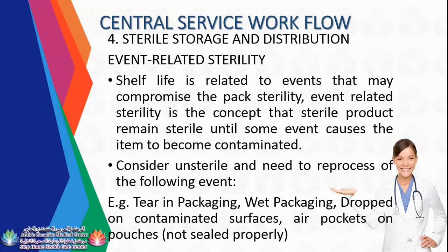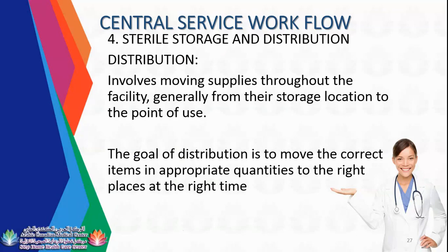Consider it unsterile and in need of reprocessing after the following events: tear in packaging, wet packaging, drop on a contaminated surface, air pockets, or pouches not sealed properly. Distribution involves moving supplies throughout the facility, generally from their storage location to the point of use. The goal of distribution is to move the correct items in appropriate quantities to the right places at the right time.